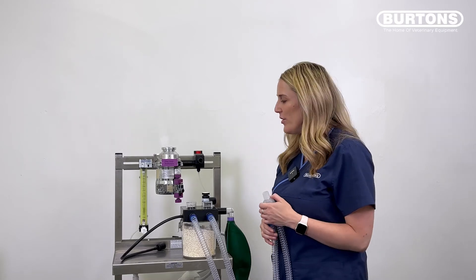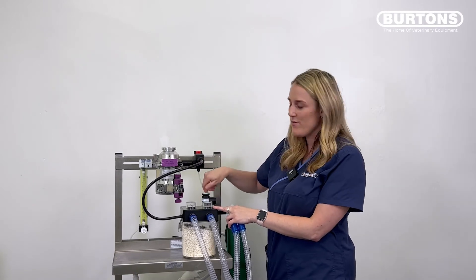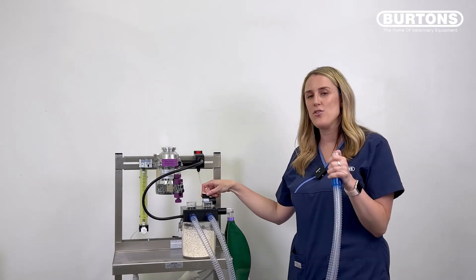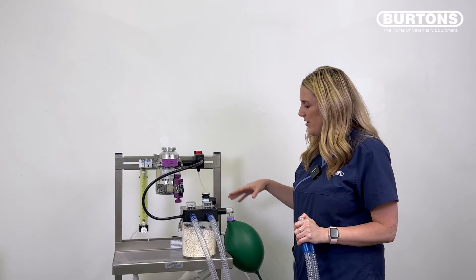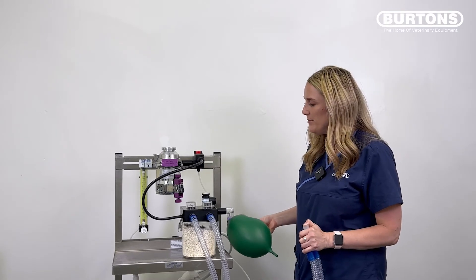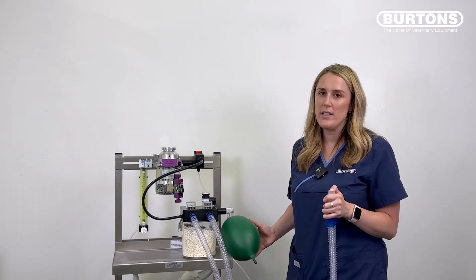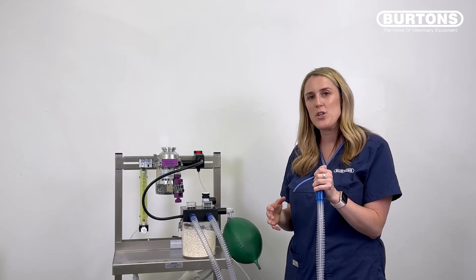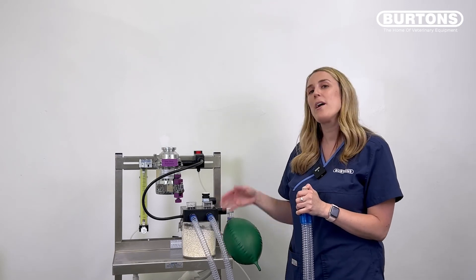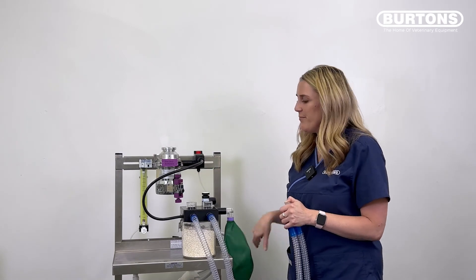In this video I'm going to show you how to leak test the Burton cycloflow. Plug the cycloflow into the common gas outlet, close the scavenging valve, occlude the patient end, and introduce gas flow. You can see the reservoir bag is nice and full and holding pressure, and the valves are fluttering. Once you've finished the leak test on a circle system, don't just lift your finger off the patient end — the change in pressure can suck CO2 absorber back through the system. Open up the scavenging valve first to relieve pressure, then take your finger off.